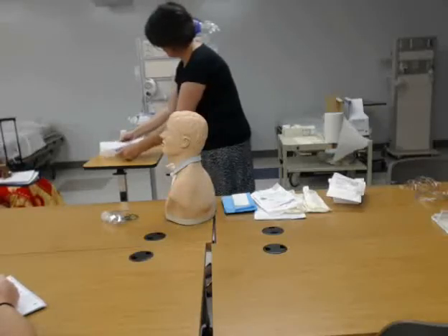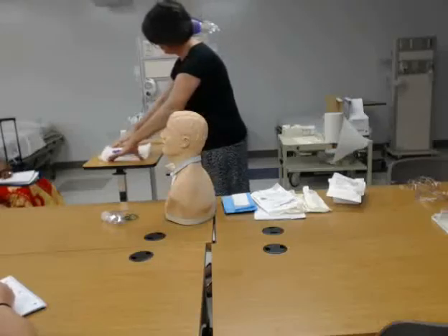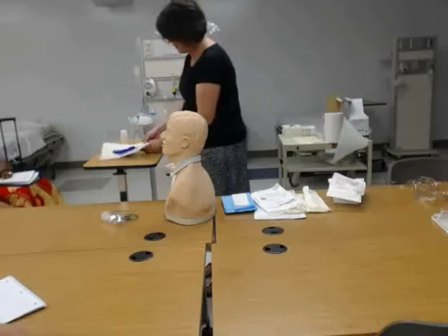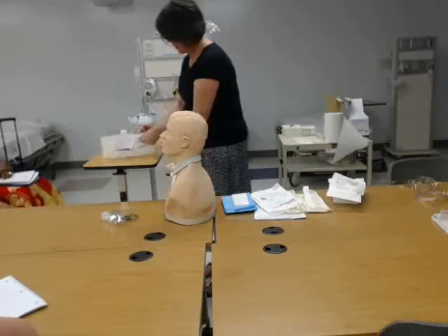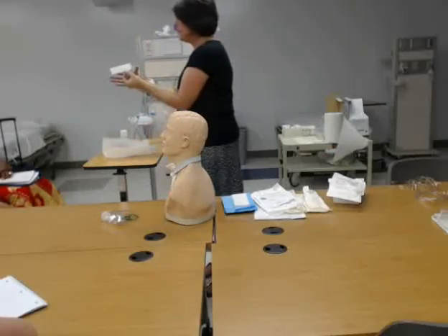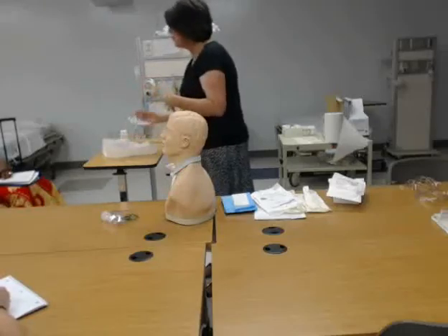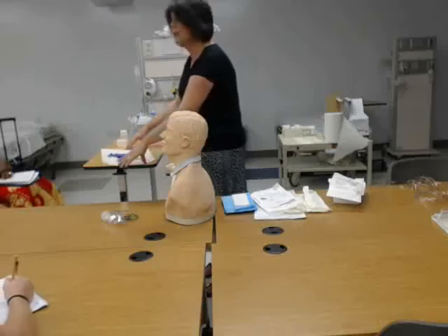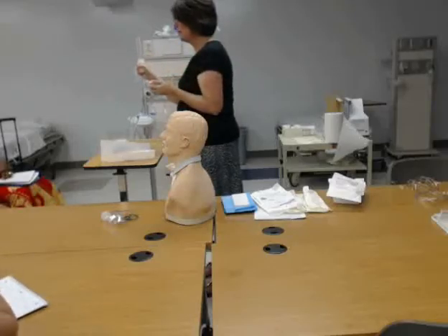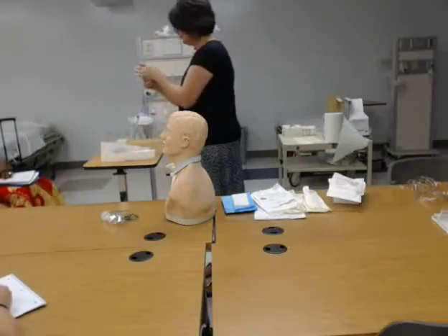I'm going to open that up. My sterile paper — the inside is sterile, and the outer one inch is not sterile. I want to get to that little box, and I can handle it by the end, because it has to stay sterile inside. I just put it like that, which kind of plumps it open, and I can set it down. Before I put my sterile gloves on, I'm going to fill it with saline, because I can't touch the saline bottle once I have gloves on. If it's already been open but within the past 24 hours, I will lip it. So I'm going to pour some saline into the container and set that aside.